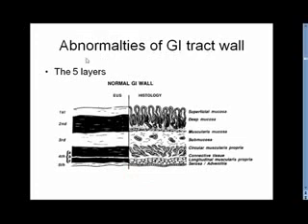Endoscopic ultrasound is the preferred method to evaluate abnormalities of the GI tract wall. The reason for this is that there is a correlation between histology and endoscopic ultrasound appearance. The following correlations can be made.